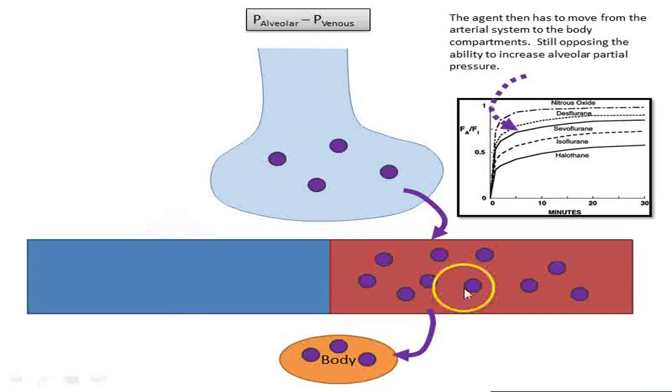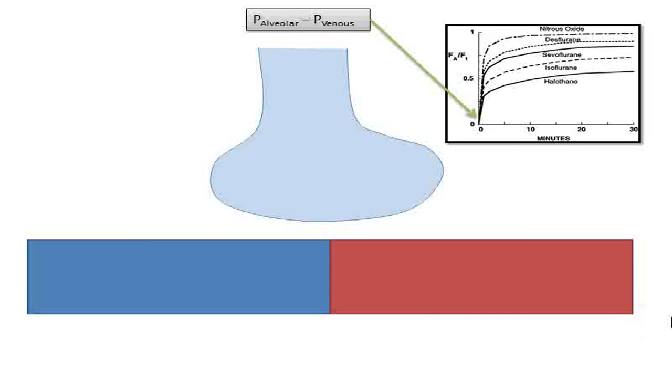Or at least starting to feel a little FA FI curve. That FA is your end tidal agent concentration divided by the concentration of the agent that you're inspiring. And when we don't have gas on, there's nothing there. It's zero. Okay? But we prime our circuit, and you take a deep breath.